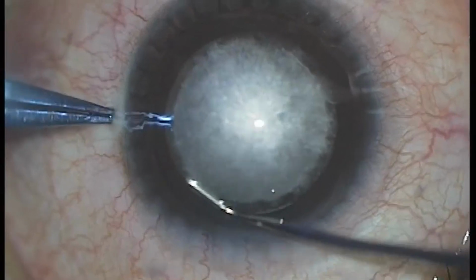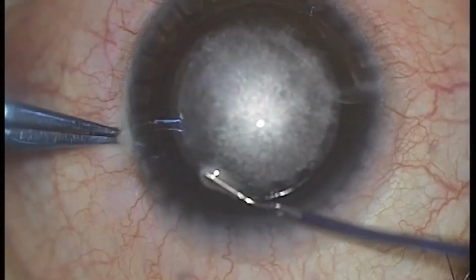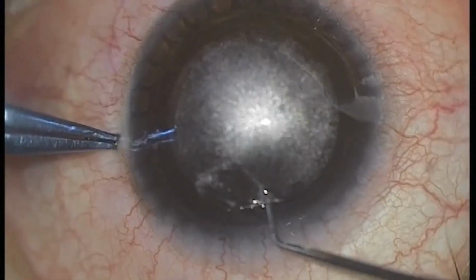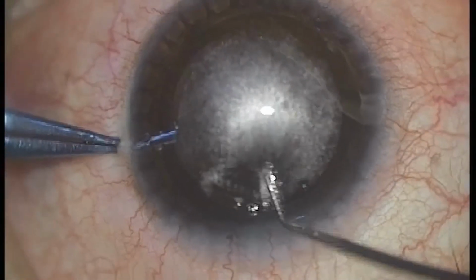Showing you another case. As a routine, initial anterior plane pocket was created on one side and posterior plane pocket was created on the other side.